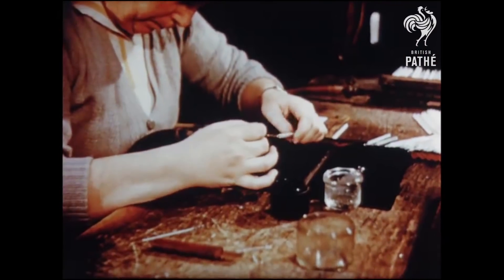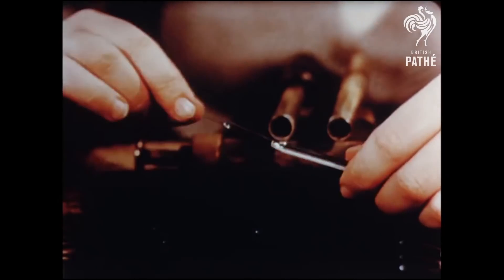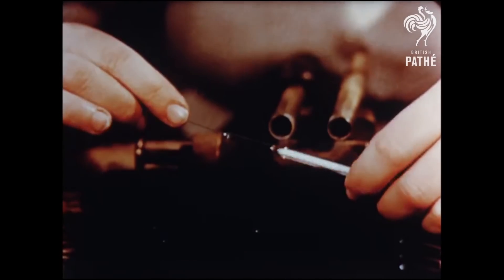Thermometer making has become an important industry in Britain, some three and a half million being produced every year, counting clinical thermometers alone.